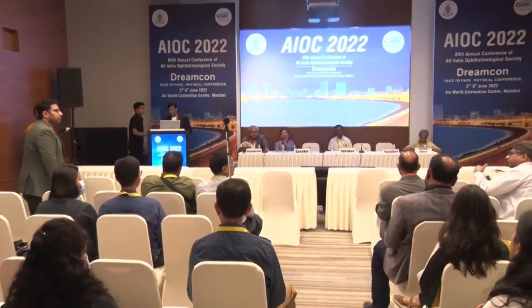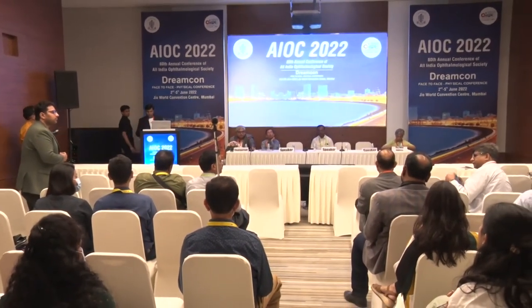Yes, please. As you have said, the IOL Master 700 incorporates the posterior corneal curvature. So if you are using it for toric IOL selection with the Barrett formula, will there be some discrepancy? Because the Barrett formula also takes into account some posterior corneal curvature, and the IOL Master takes it into account as well. So, will it be twice?